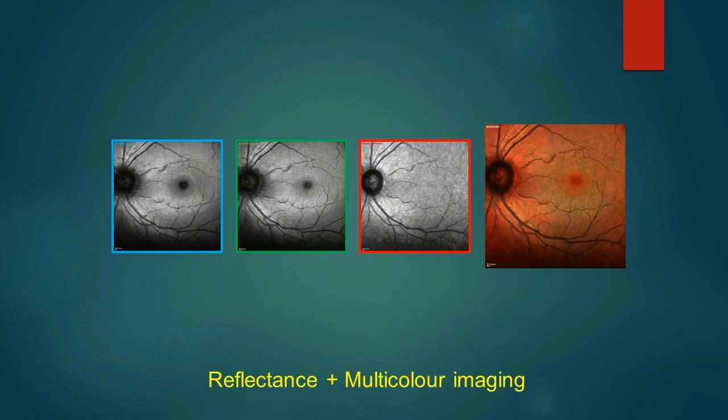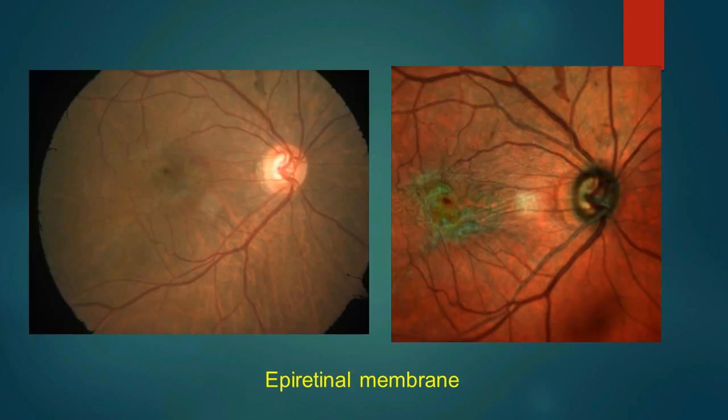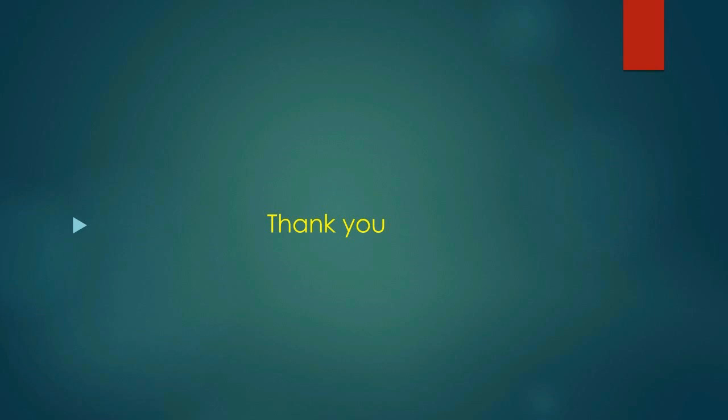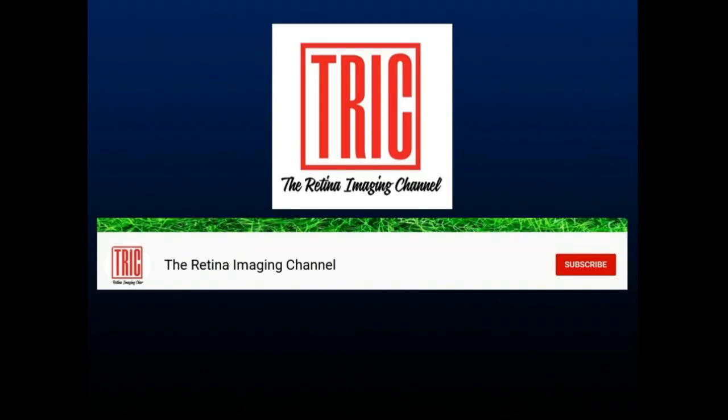Multicolor imaging is based on blue, green, and red reflectance. Here in the right image you can see how beautifully an epiretinal membrane is highlighted in green. Essentially, blue, green, and infrared channels give information from various layers of the retina. Thank you very much.